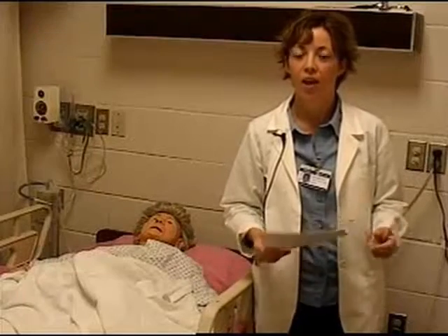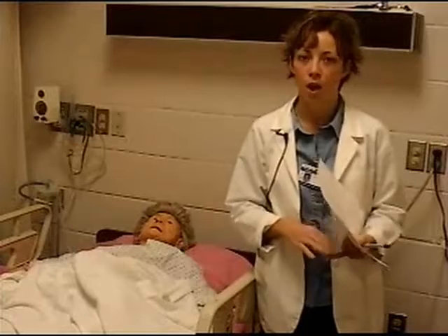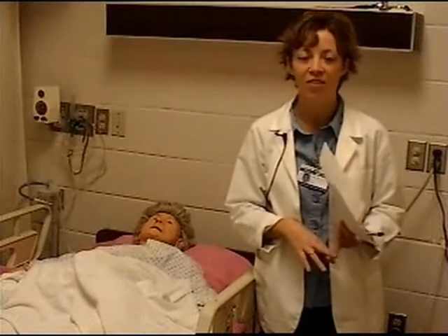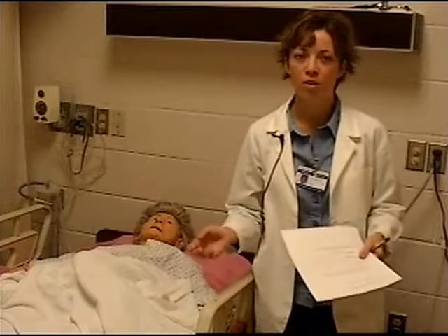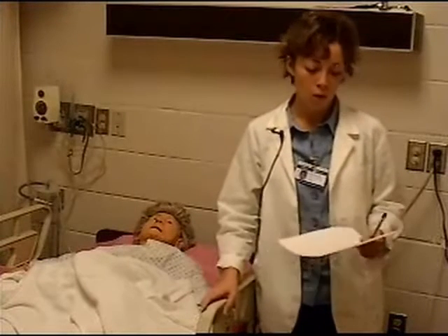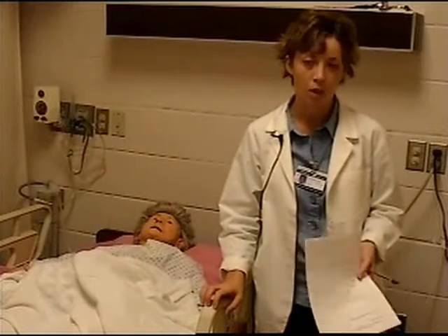I'm going to talk today about chest tubes. First we're going to start with some different things that can cause a need for a chest tube. I'm not going to define them, but I'm going to give you causes. The first one is a pleural effusion. Pneumonia or systemic lupus can cause the need for a chest tube.